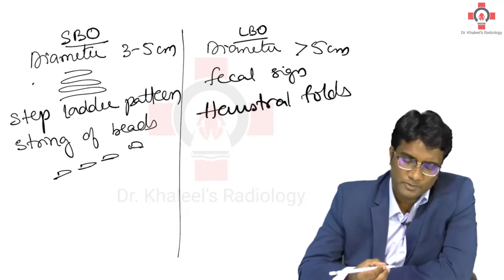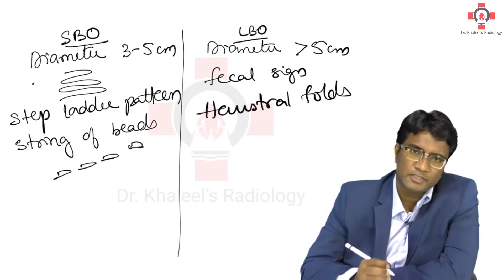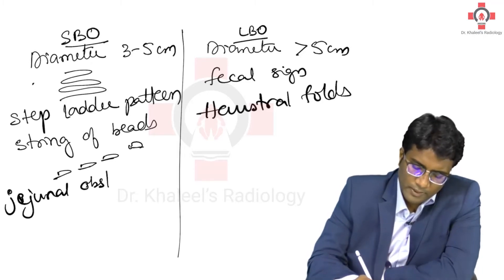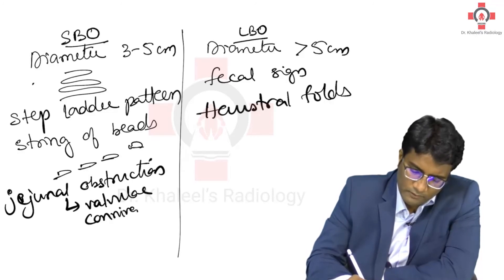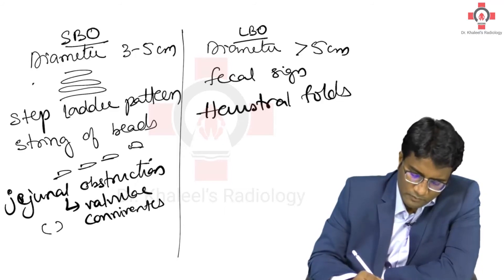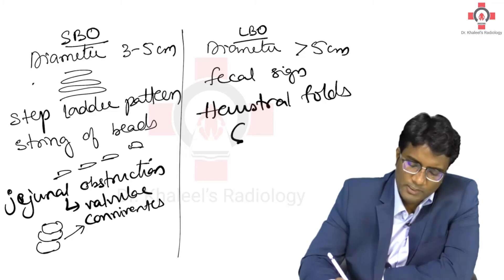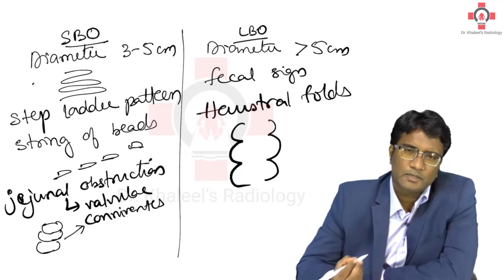Small bowel loops would not have haustra folds. The important finding in small bowel obstruction, especially in jejunal obstruction, is the presence of valvulae conniventes — circular mucosal folds which run through and through the bowel wall. Haustra, by contrast, are only at the periphery of the bowel.